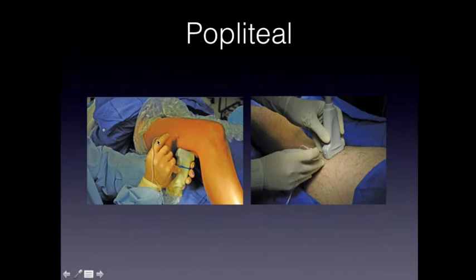You can keep the patient in this position without changing and perform the block, and the same goes for the anterior approach, the proximal one that we mentioned before. When you cannot put the patient in prone position for a special reason, this is a very useful technique. But at the same time, this is a very useful technique for practical aspects, because here you do not have to change the patient positioning.